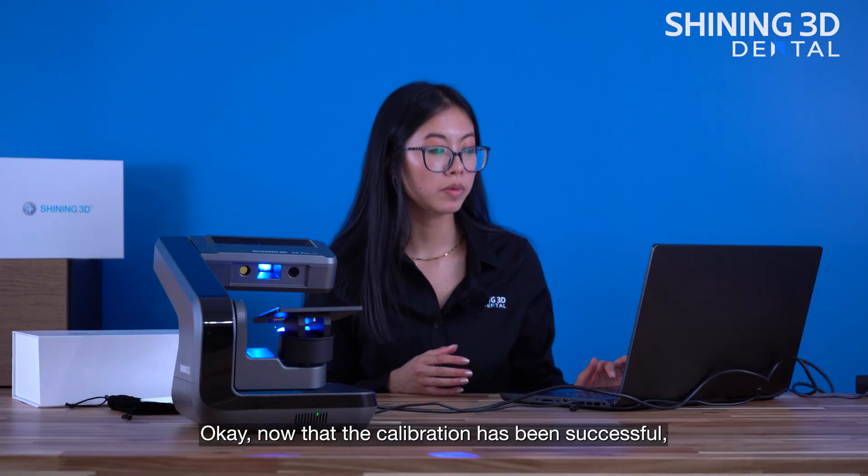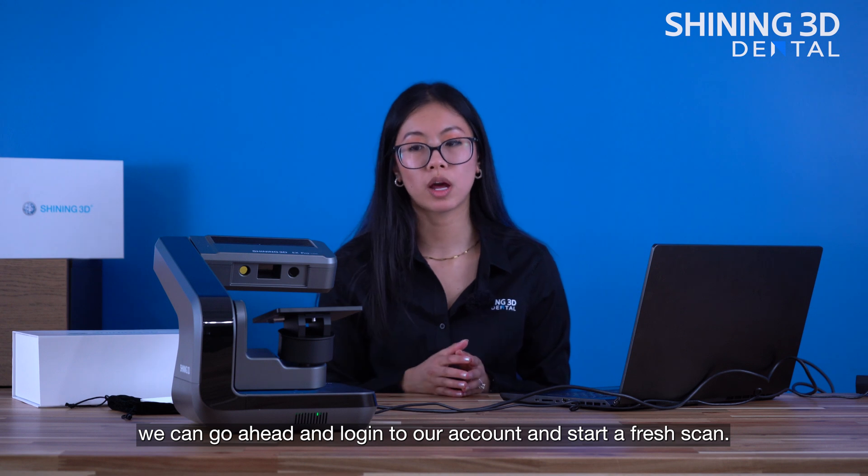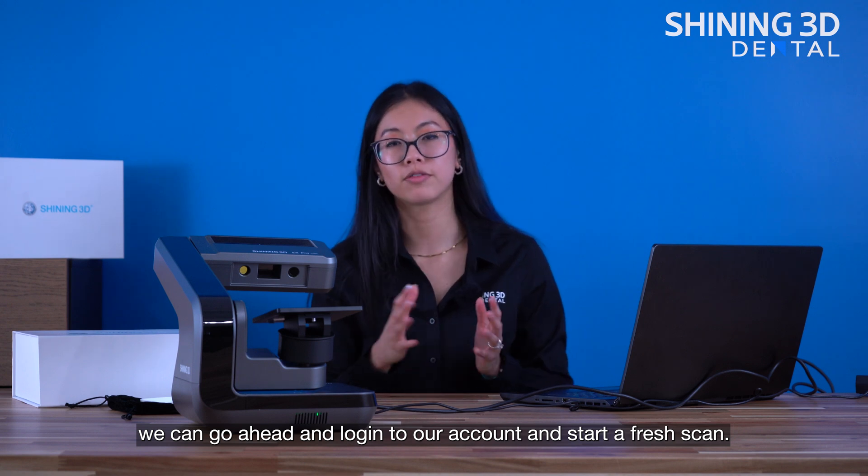Now that the calibration has been successful, we can go ahead and log into our account and start a fresh scan.